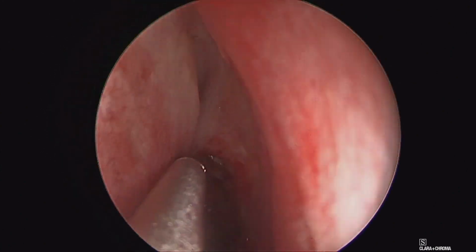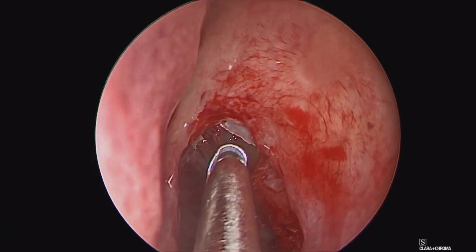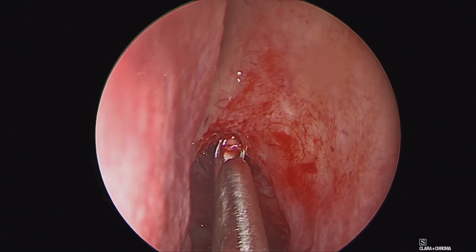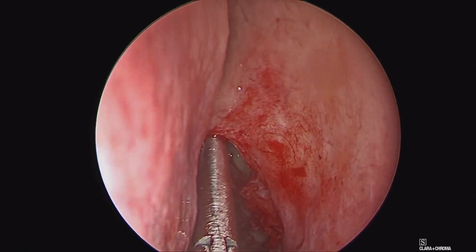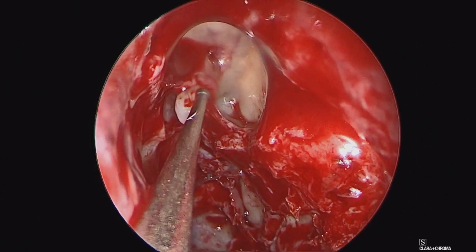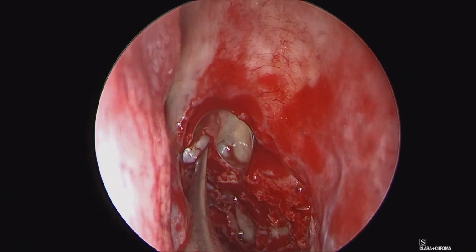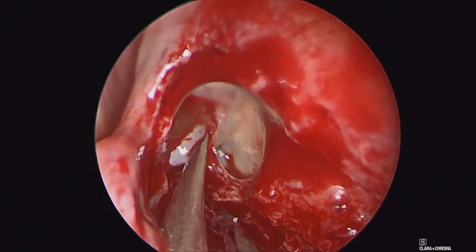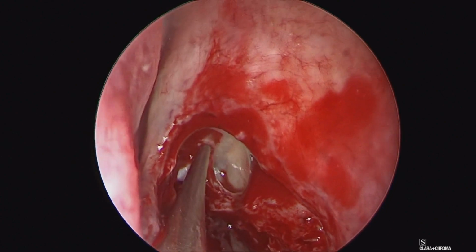And then again, for long-term surveillance, I also like to open up the remaining portion of the sinuses on this side, including the frontal sinuses you can see here, in order to allow us full access to the area postoperatively. I find that when you don't fully dissect out the entirety of the sinuses on the ipsilateral side, you can easily be mistaken by some mucosal edema or other debris following surgery and worry that's an inverting papilloma recurrence later on.